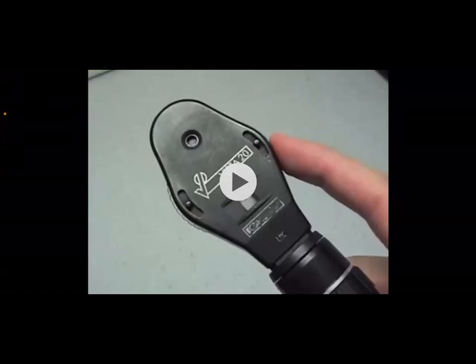So if you use an eyeglass, better you remove it. Okay, and then proceed with the examination. The first step in examination is to check for the red reflex. Check for the red reflex.